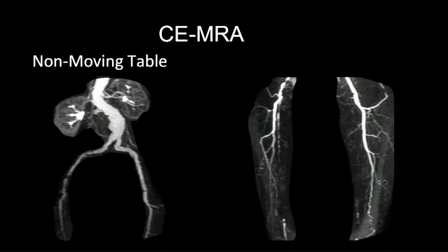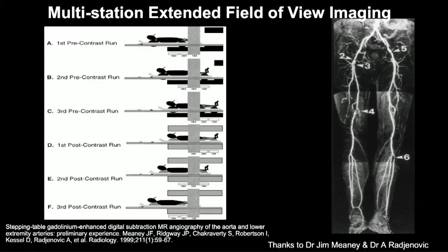I'm lucky to be young enough to not have practiced in the day of single station non-moving MR angiography. Image quality has always been very good, and what we've really added with table motion is the ability to cover more of the patient.